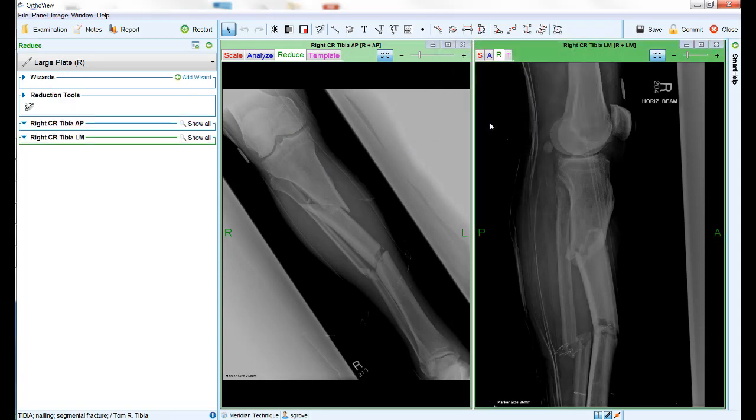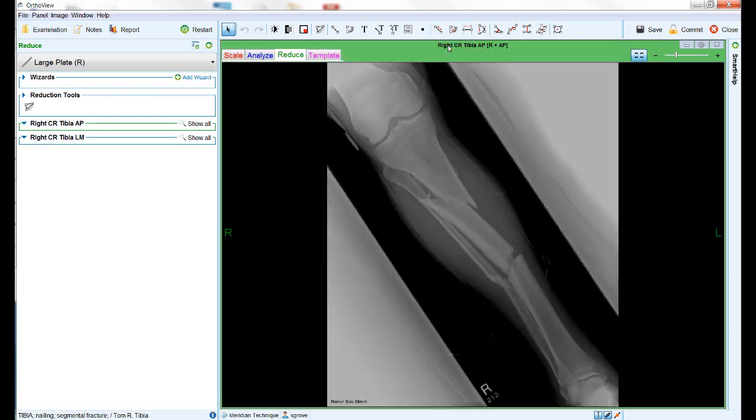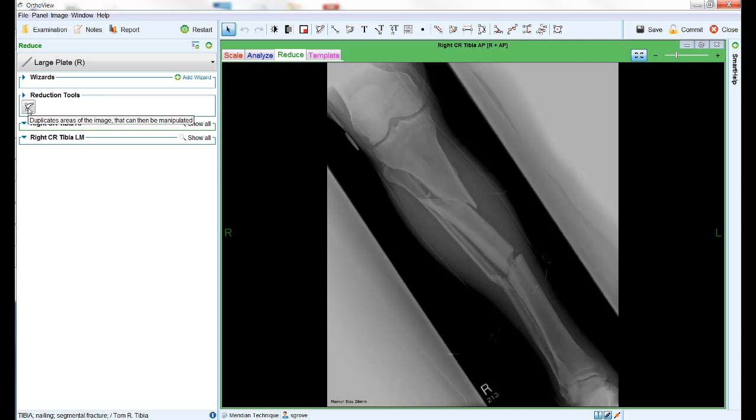The software now automatically moves onto the appropriate step for the chosen procedure, in this case to the reduce tab to enable reduction of the fracture. For the remainder of the tutorial we will concentrate on the AP view, however everything we do on this view can be replicated on the lateral view. On the left of the screen you will see the one available tool in this tab, the reduction tool.